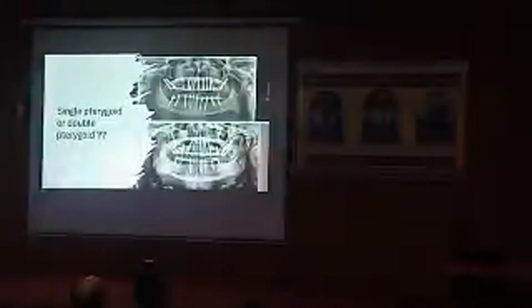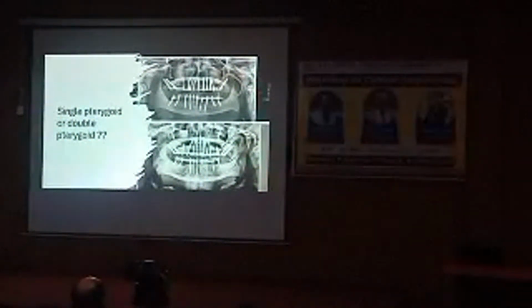Again, why does failure happen? Lesser planning, lesser execution. You have placed perfect 4 implants anteriorly and 1 posteriorly, but the span is more than 10 mm. Again the entire pressure will go on these anchored implants. So one parameter you will decide with is the span length.